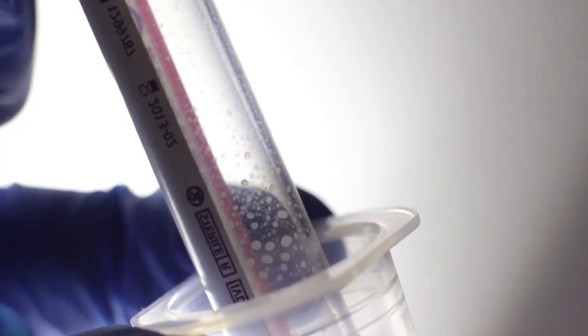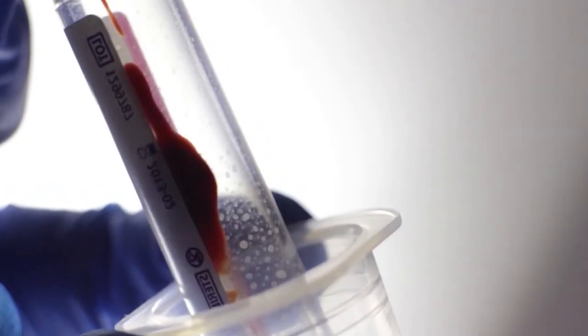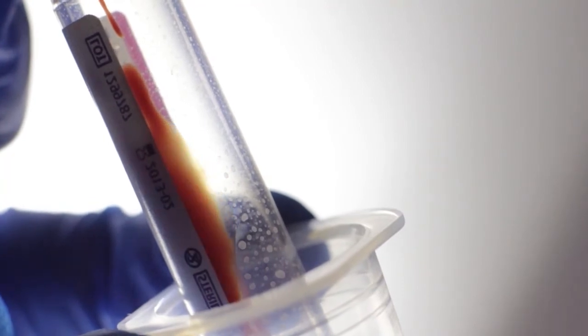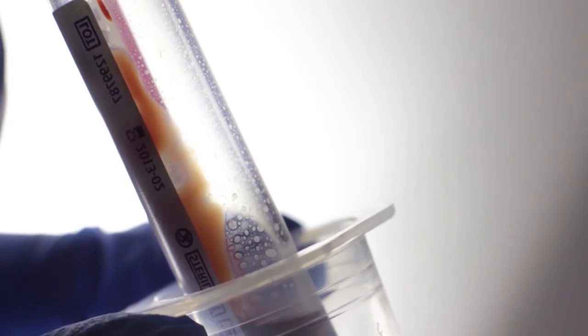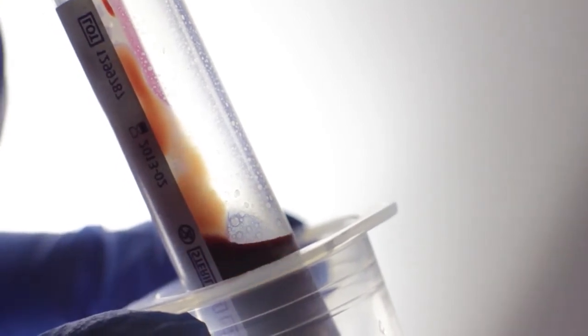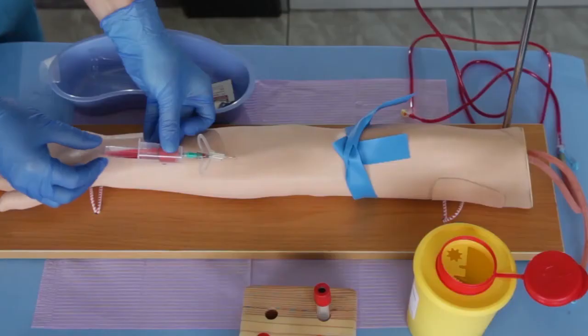While supporting the vacutainer tube holder, push the vacutainer tube into the hub and check for blood flow. Allow the tube to fill, then remove it from the tube holder, all the time gently supporting the tube holder to prevent the needle from slipping out of the vein.